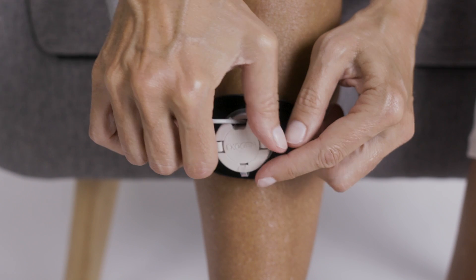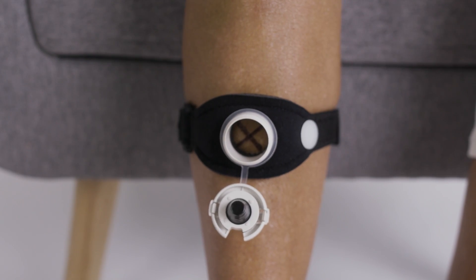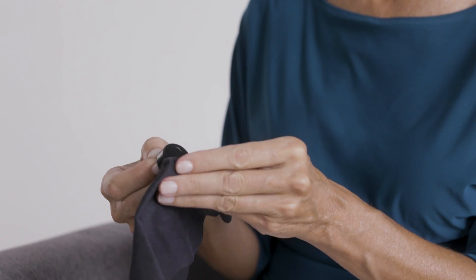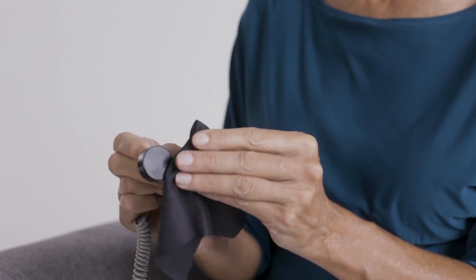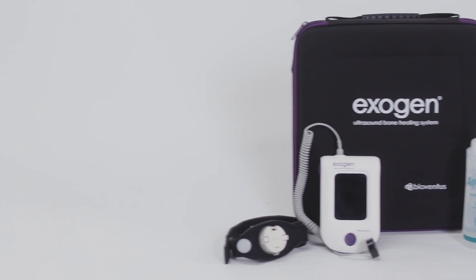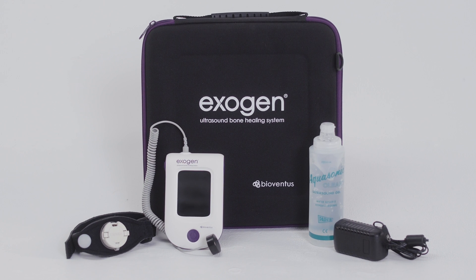To clean your device, squeeze the tabs to open the cap and gently remove the transducer. Wipe off the gel with a soft cloth, cotton swab, or paper towel. Do not use cleaning fluids on any part of the Exogen device. Remove the strap and clean the gel from your skin and the strap. Store all the Exogen components in the carrying case so they don't get lost or damaged.